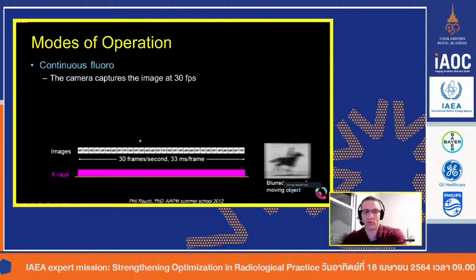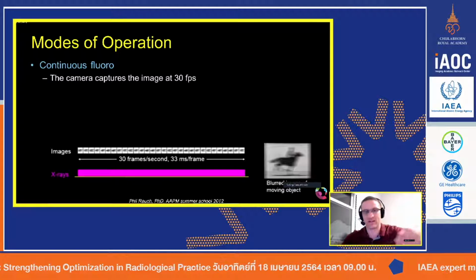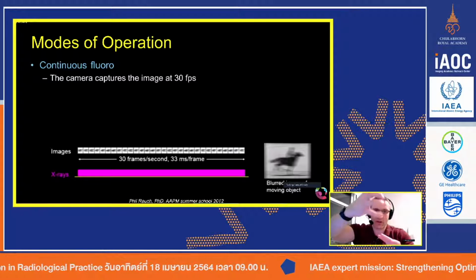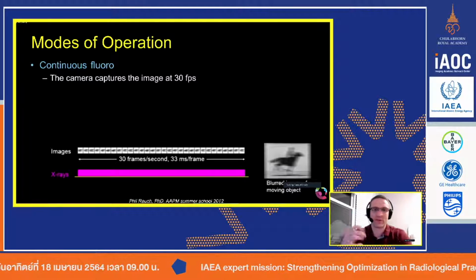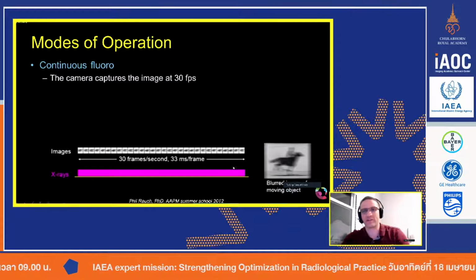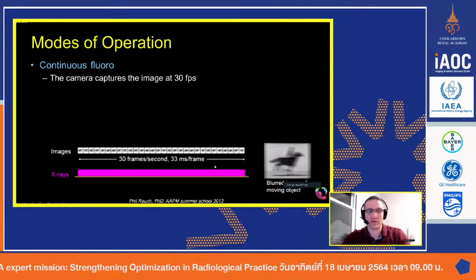That's the whole reason we originally started doing this in fluoroscopy back in the 80s and 90s, because you had the II and you quite literally had a camera on top of it, just like when you're filming a movie, with film cycling through. And you were quite literally creating a movie.